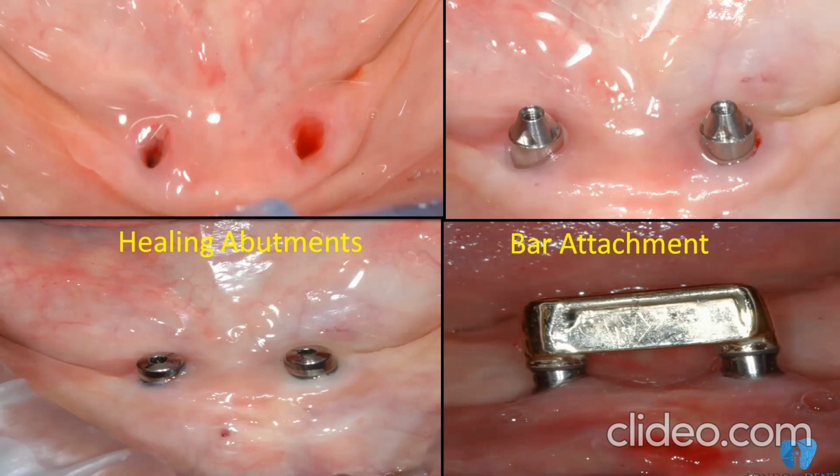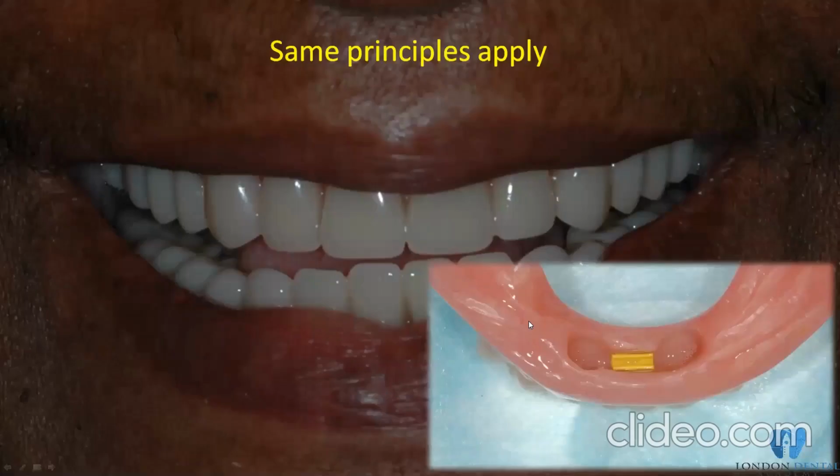Nowadays we have got all in CAD/CAM. This was done a long time ago. But you need to make sure that when you do your cases, please make sure you don't do bulky cantilevers. Again, this is biomechanically not acceptable. And then the inserts, as you can see, a single insert sitting on top of the bar. The same principles apply in terms of occlusion, aesthetics, and all the above.